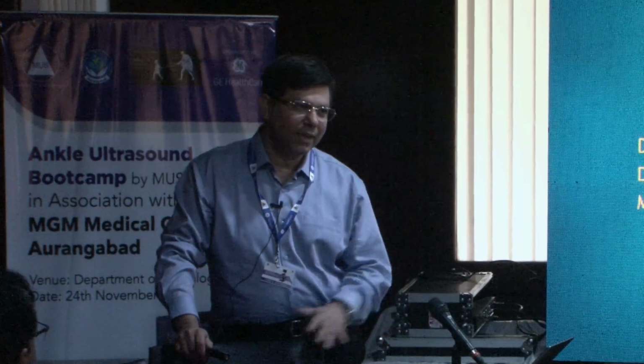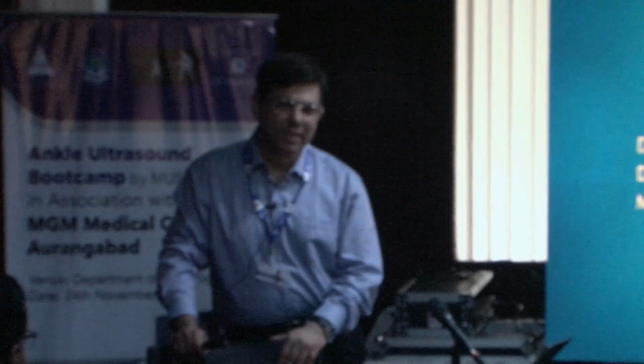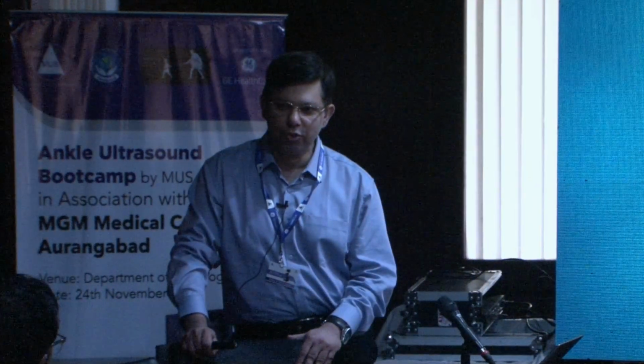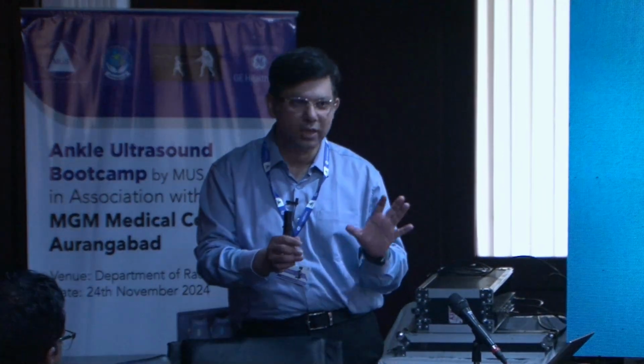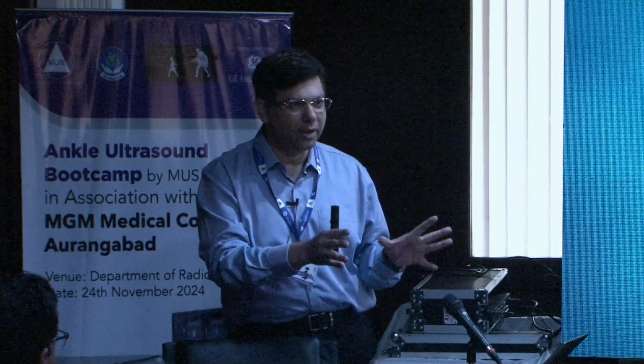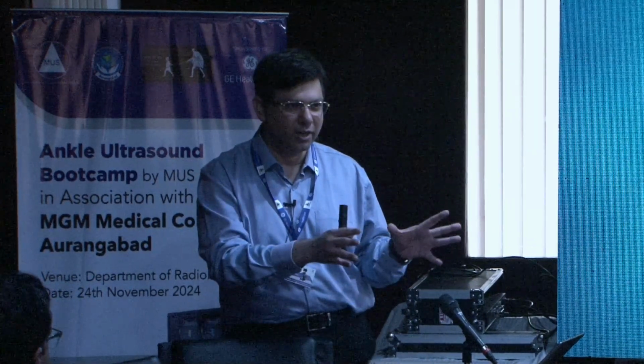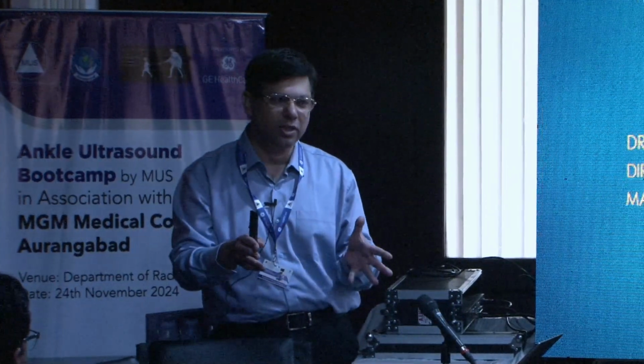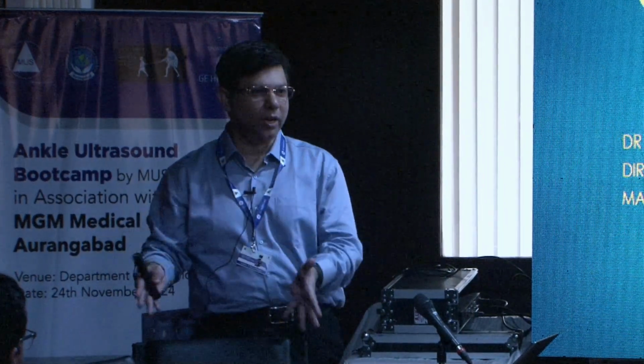So for the next 30 minutes, we'll discuss the normal sonoanatomy of the ankle joint. I'll show you a gross anatomical picture, how you keep the probe, how you obtain the image, and what the image looks like.